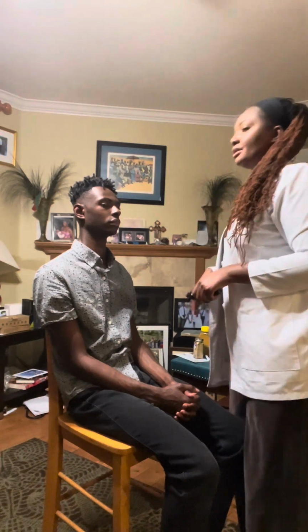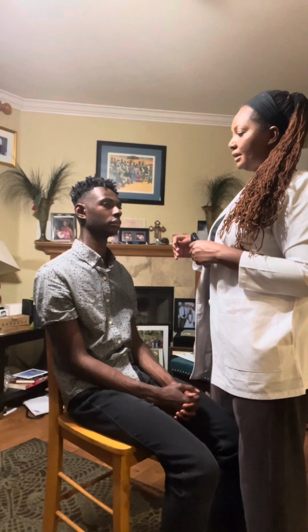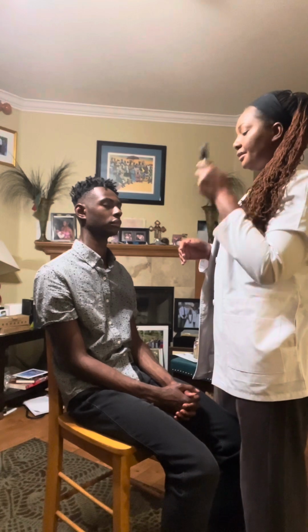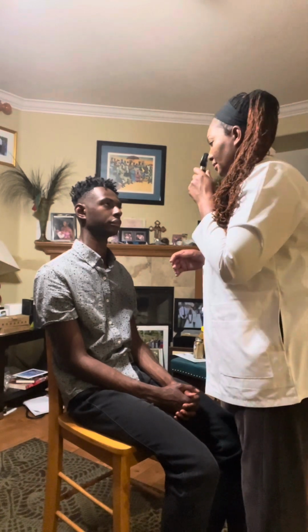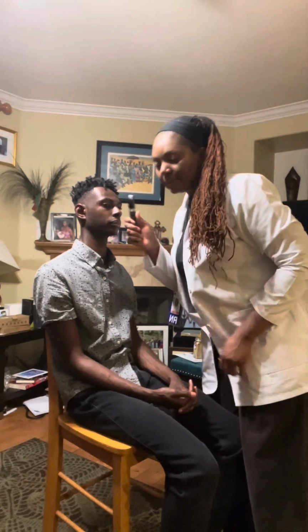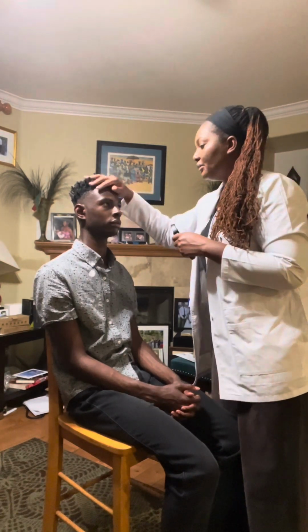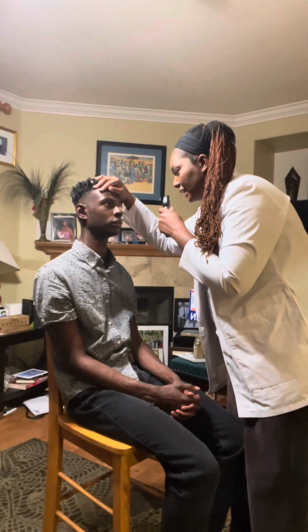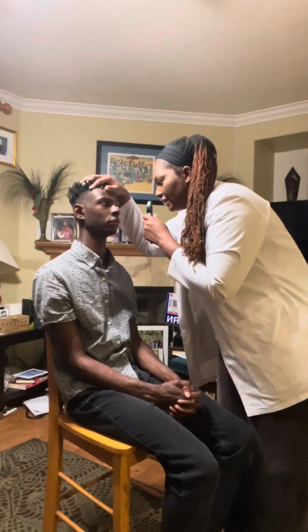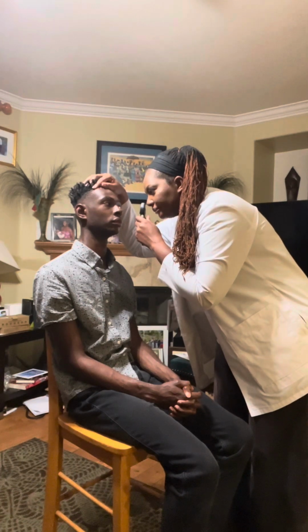Okay. So with the eyes, I am going to check the patient's eyes. Normally I will use my right hand and right eye towards the patient's right eye, and my left hand and left eye to the patient's left eye. Open your eyes for me, and I'm going to support the patient, and as soon as I see the red reflex, I will go at about a 15 degree angle. So I will look into the patient's eyes.